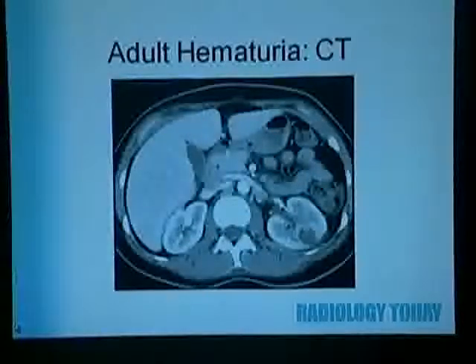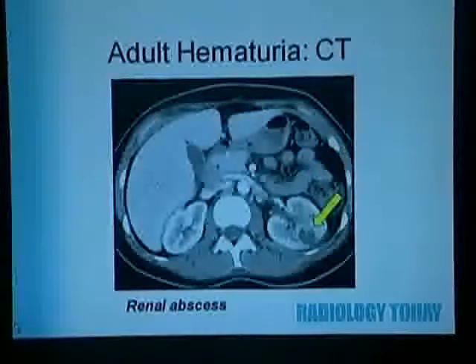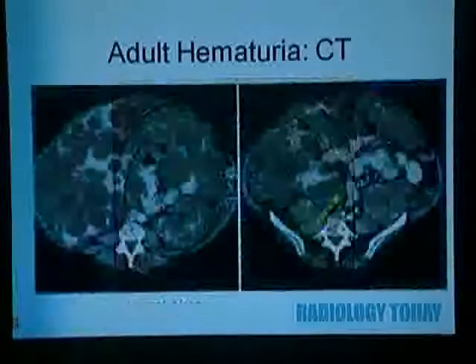Now, again, here's a case where our conclusions are based on your clinical opinion. This is a patient who had pyelonephritis. They came back in and had a CT and had this small fluid density mass in the left kidney. In itself is quite nonspecific. Is it a cyst? Other etiologies as well. But in the case of having prior pyelonephritis, the suspicion for a renal abscess was raised. And on percutaneous drainage, this turned out to be a renal abscess.